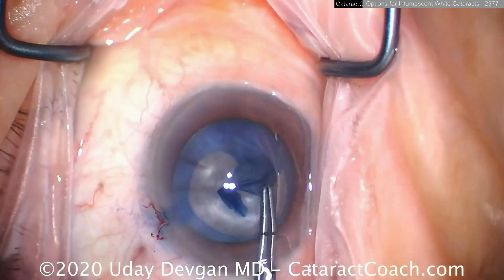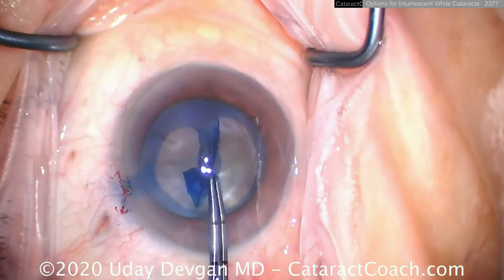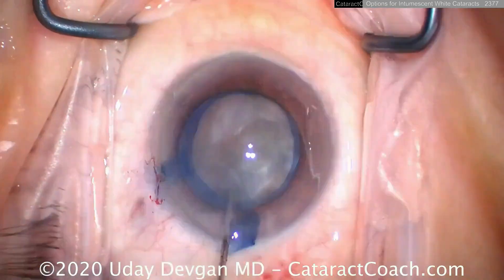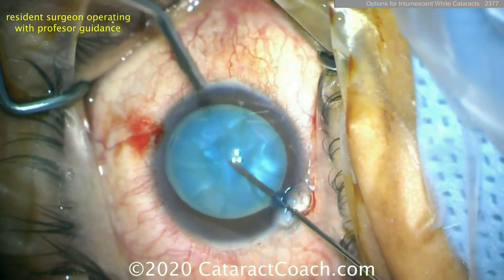I've got to use that little maneuver — pull backwards into a capsule rescue technique — and again I can complete the rhexis here. But watch as I go over here: I've got to pull in the opposite direction just so it doesn't run out. So there's less control this way, and there's all that intumescent lens material.